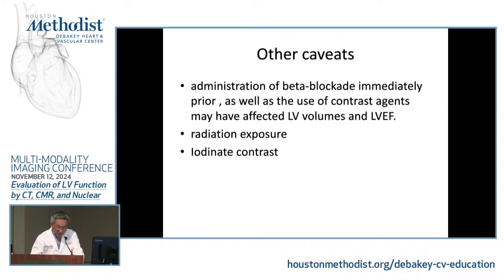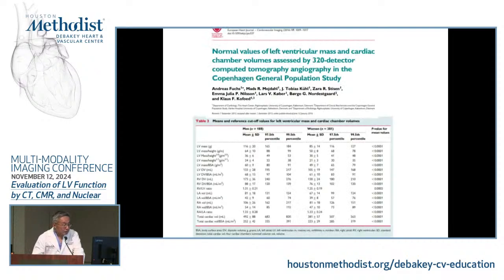Obviously, radiation and contrast is the main issue. And this is the normal volume. So, Man, let me know, does it differ too much from CMR, or is it essentially similar? It looks very similar. Yeah, I mean, it's a similar technique.